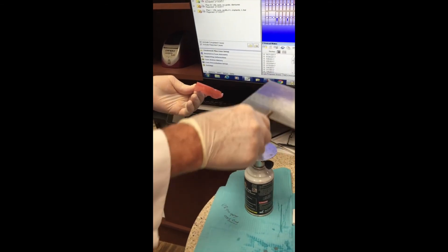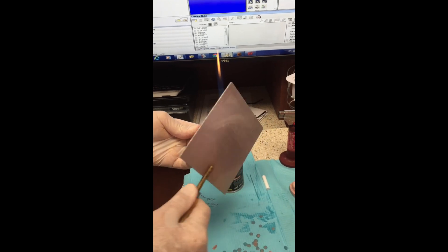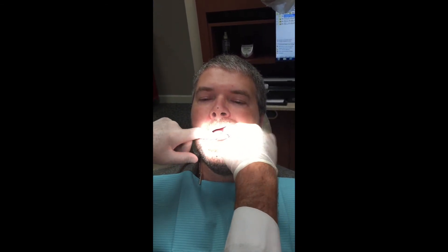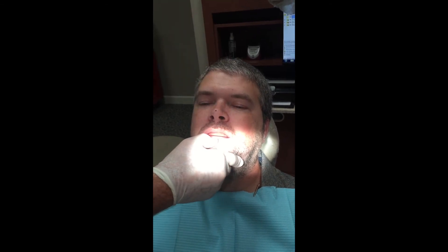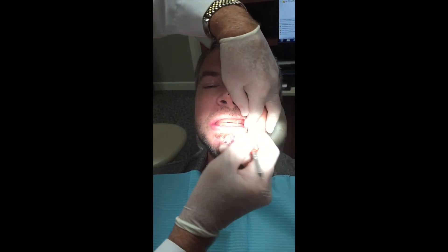The wax rim needs a little more adjusting. Keep the hot plate moving through the flame. This was just a little pouchy on his lip here. We're pretty much ready to go back to the mouth now. Again, we're going to rotate with nice, smooth, gentle actions, pull the lips out of the way so the tissues don't get up underneath the record bases. We're going to snug it in. We're coming with the upper — it helps to wet it a little to put a little more suction to it. I'm going to steady it with two fingers, then we're closing on the back teeth. I'm now going to connect my midline here to give the lab a little more mounting orientation. We're going to drag the cuspid line on down — you can see the V's that I've cut right there.